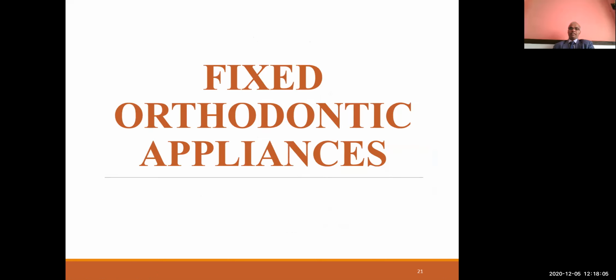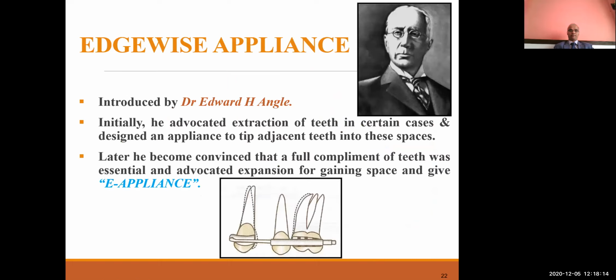Then I am discussing the various fixed orthodontic appliances, evolution of edgewise appliances and various other appliances.